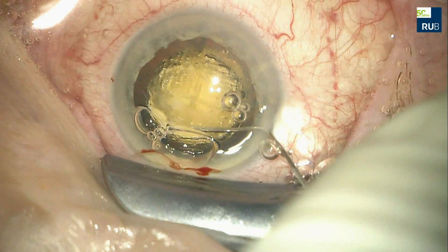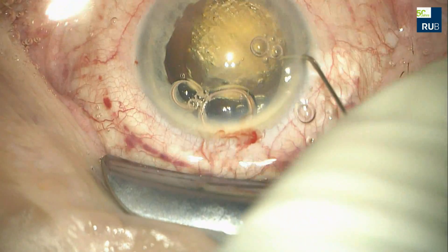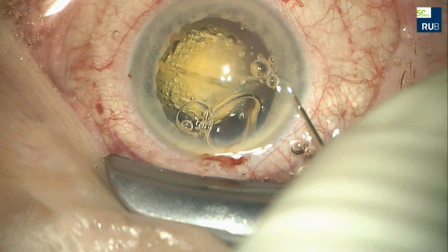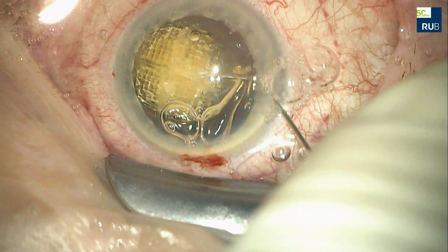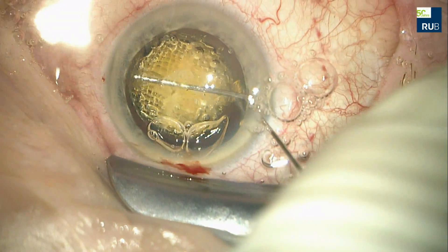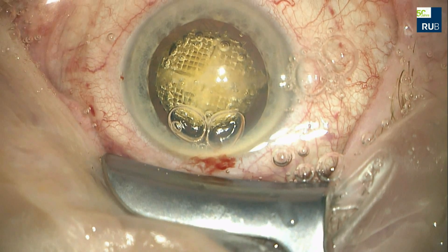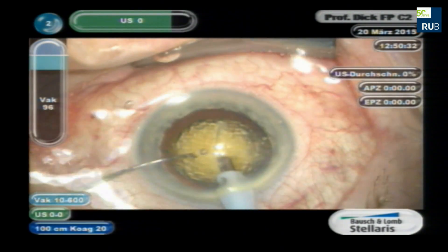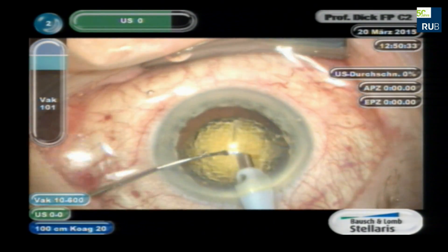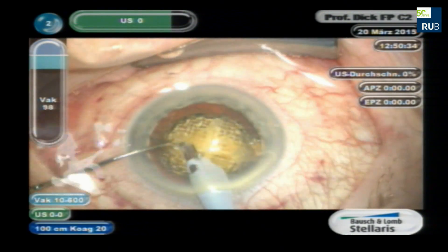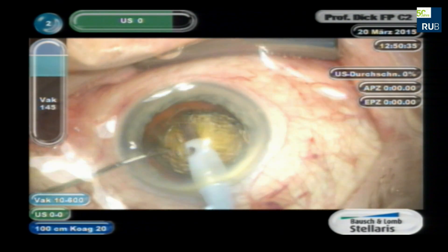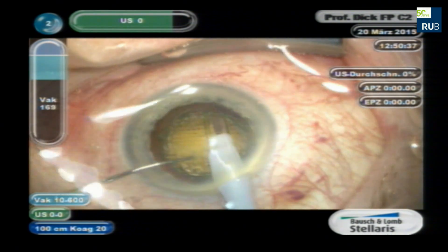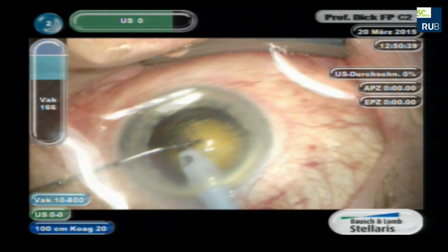Hydrodissection is performed and the lens is rotated so that it moves freely within the capsule. The lens quadrants are being separated and the fragments are removed using aspiration without the use of ultrasound energy.